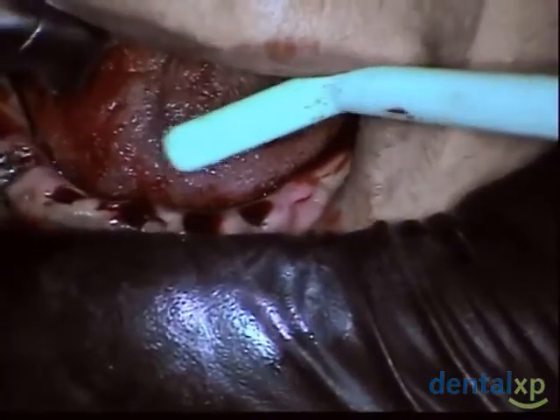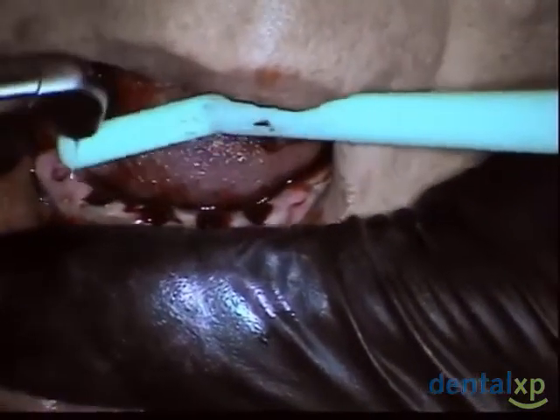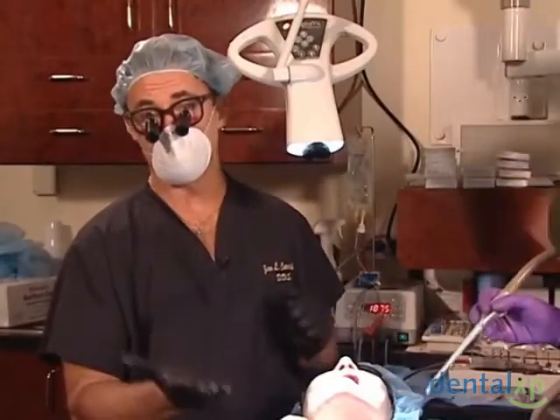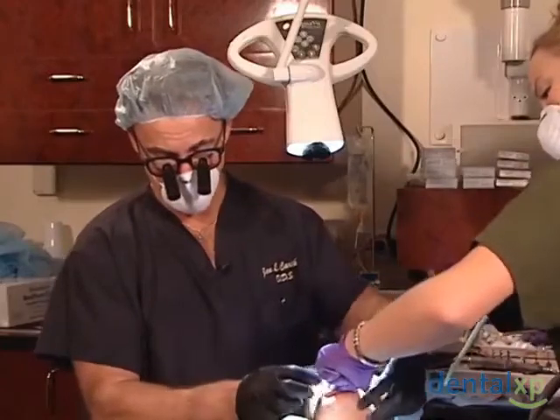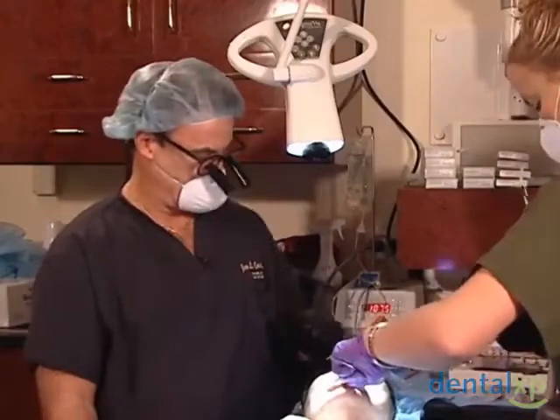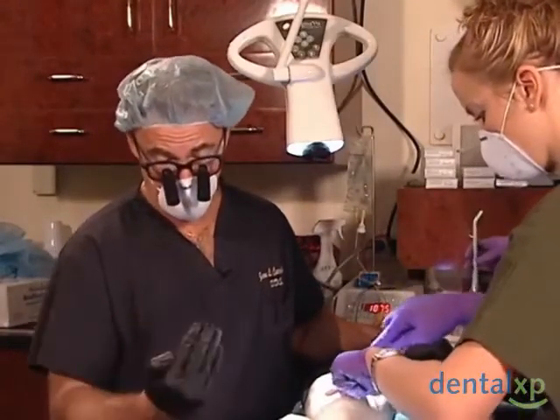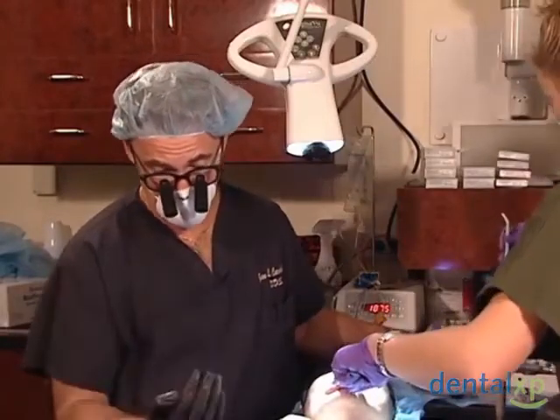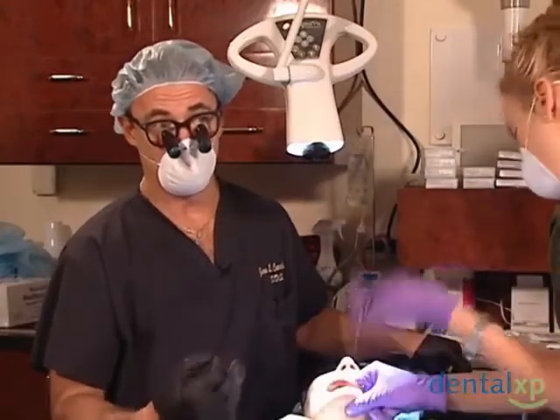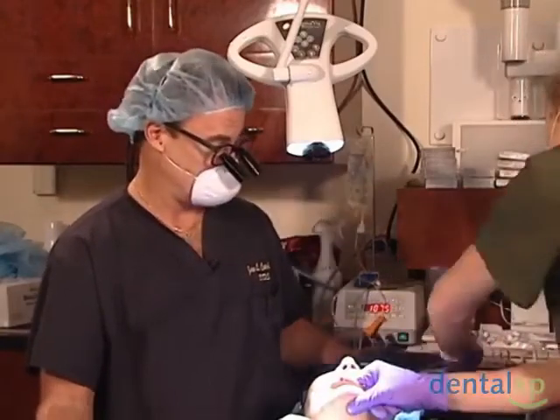However, what that does is provides us with an implant-supported, implant-retained prosthesis. Not only that, it elevates the rotation point anywhere from 8 to 10 millimeters above crestal bone. So when you look at it, we are now doing everything we can to displace adverse forces on the implant. So what we're doing now is taking the bars off, reducing height, reducing tissue if necessary, and then refitting the existing implants with either an ERA abutment or placing ERA implants to lower those rotational forces.